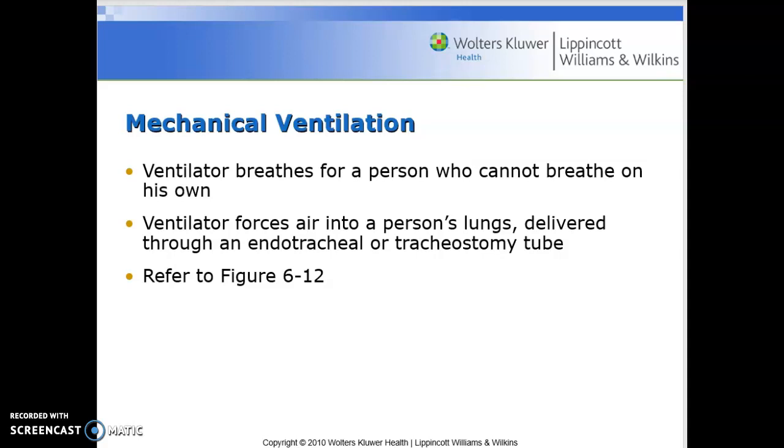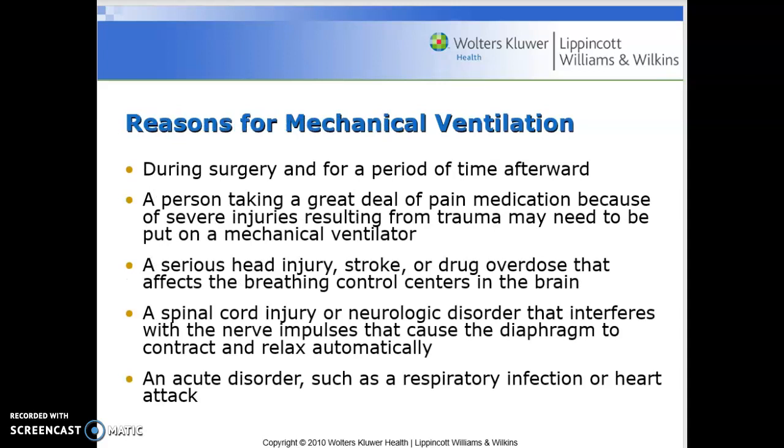It's important for the assistant to know the meaning of what alarms are what while they're performing care. What I mean by this is there are different alarms that sound off from a mechanical ventilator, and they're different from machine to machine. So the assistant needs to be familiar with what equipment is being used in the setting they're working in, and they need to understand what the different alarms mean. If they sound off, they need to know what to do as far as going to get the nurse, get the doctor, making sure that patient is taken care of according to whatever alarm sound they hear.